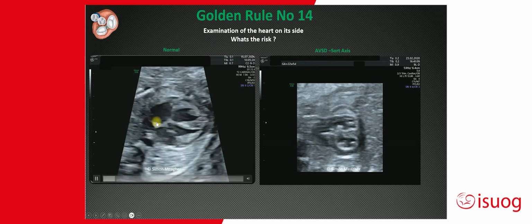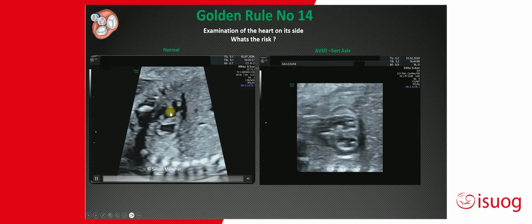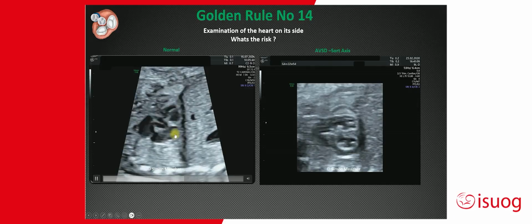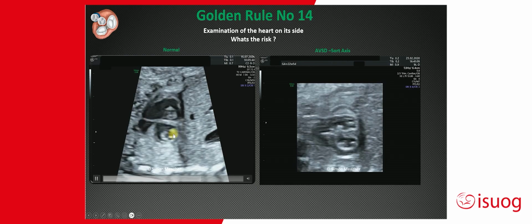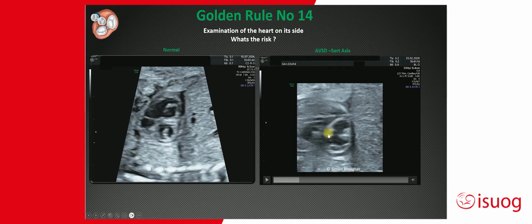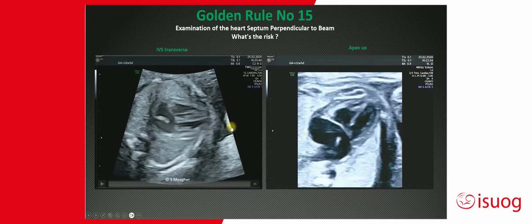So this is a 4-chamber view of the heart, and then you rotate your transducer. Now you have on top the tricuspid valve, and you can see the 3 leaflets, and the fish mouth opening and closing of a mitral valve inferiorly. This becomes important with a complete AV canal defect, that you can distinguish between complete and partial by getting that short axis view. But the only way to achieve that is with the apex on its side.